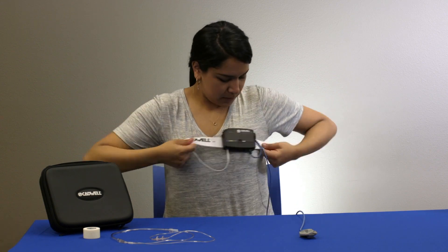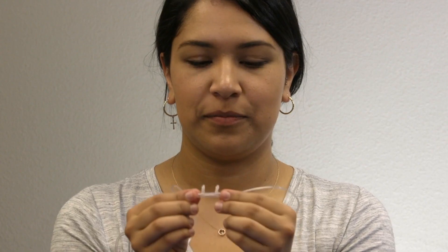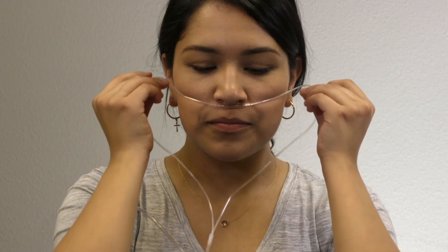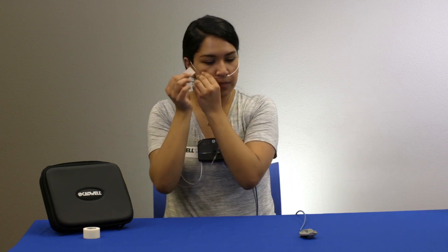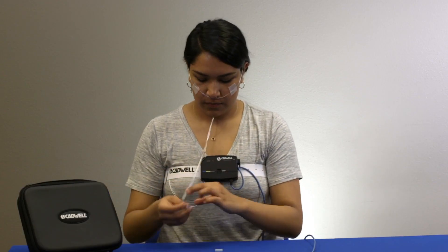You may trim the excess length using scissors if necessary. Holding the cannula with the prongs facing towards you and curving down, insert the ends of the prongs into your nose and pull the cannula tube back over your ears like a pair of glasses. Slide the tension adjusters up the cannula tubing. Tear off two small pieces of tape and secure the tubing to your cheeks. Attach the cannula by gently twisting the tube onto the metal connector on the top of the apnea track.